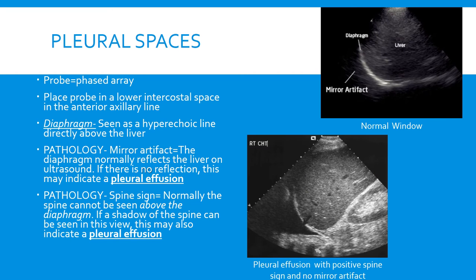To finish off the pulmonary exam we're going to take a look at the pleural spaces. For this exam we need to grab the phased array probe because we're going to be looking a little bit deeper. We'll take the probe and place it in a lower intercostal space along the anterior axillary line, and we should get a picture similar to the one on the top right.